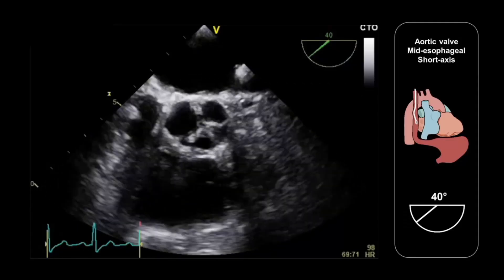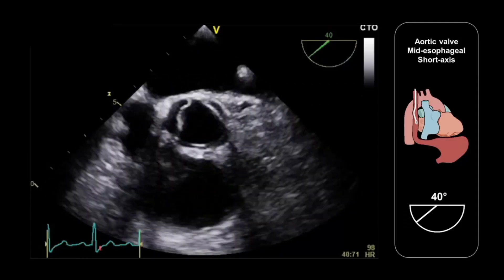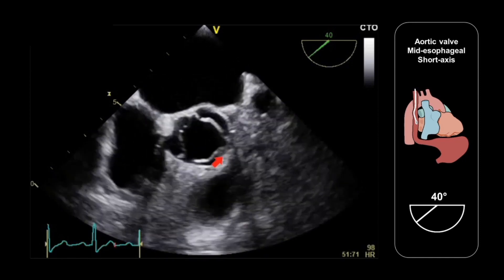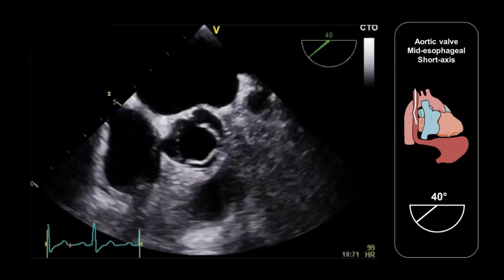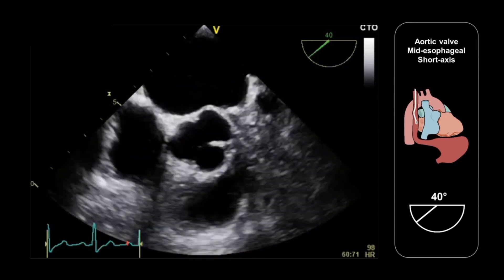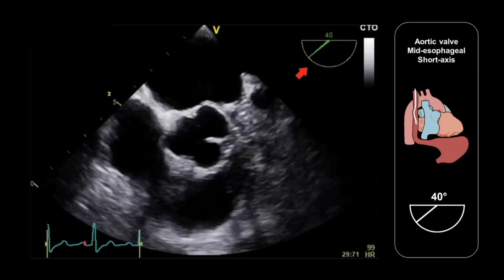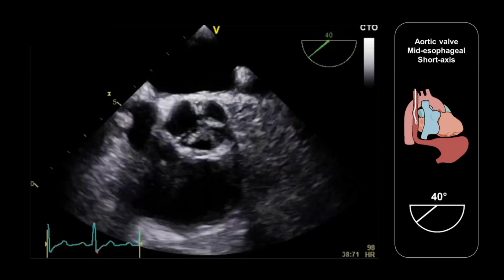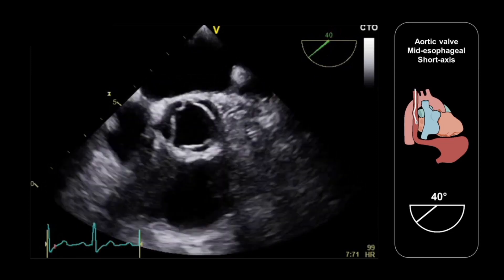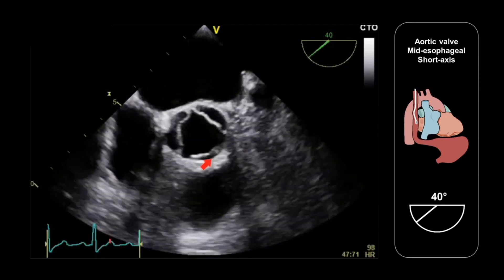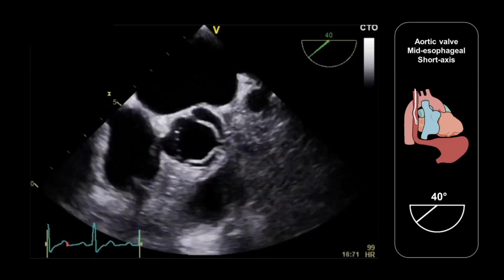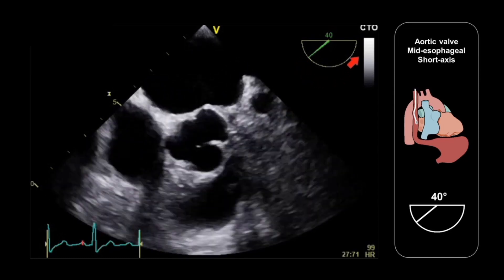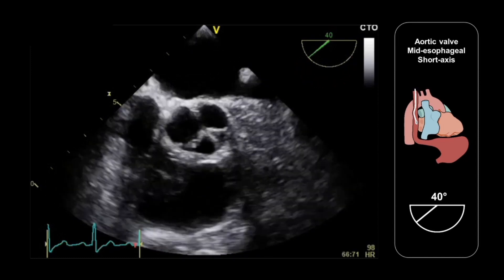In order to obtain the long axis view, I'd suggest starting with the aortic valve short axis view that we covered in our previous lesson. This is obtained with a transducer imaging plane angle of around 40 degrees, certainly somewhere between 25 and 45 degrees. Once you've obtained this view, rotate the imaging plane forwards by 90 degrees to obtain the long axis view.